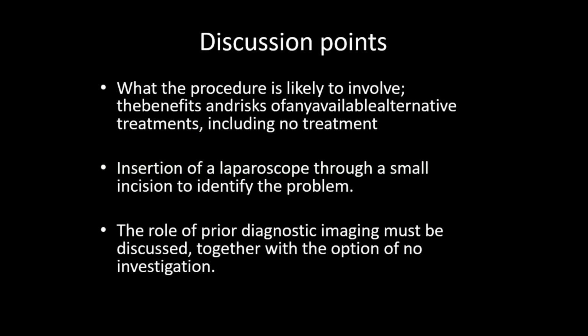So with bowel injury and bladder injury specifically, urine and feces may lead to a chemical peritonitis, so you should rapidly give the patient prophylactic antibiotics. As well, you may take a decision within 15 minutes to turn the laparoscopy into a laparotomy, so you have already given the patient antibiotics.